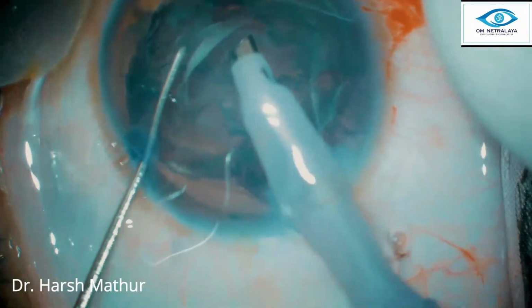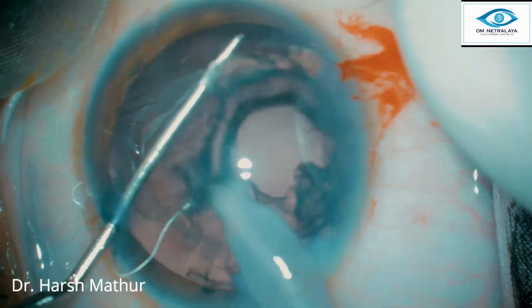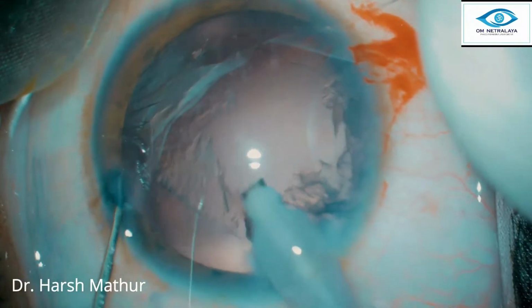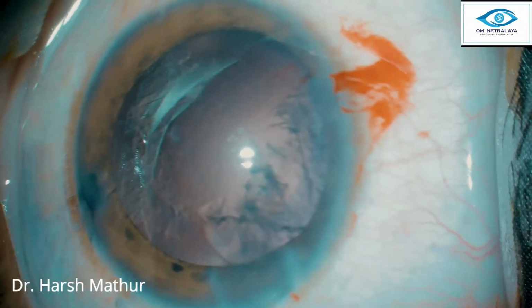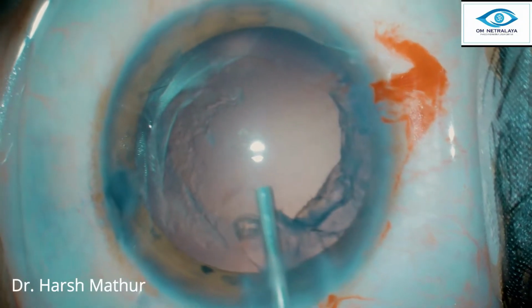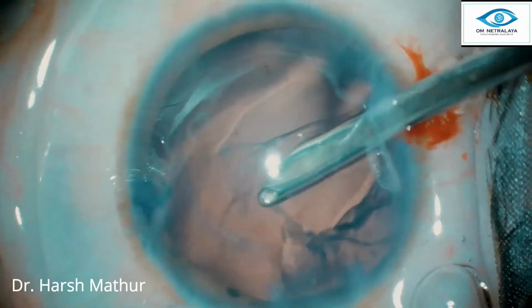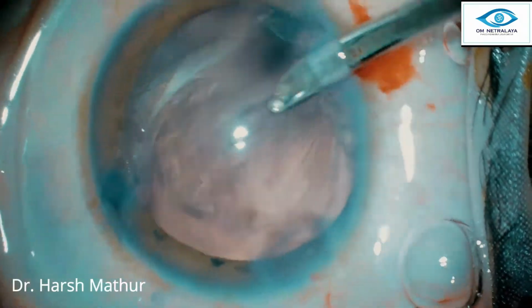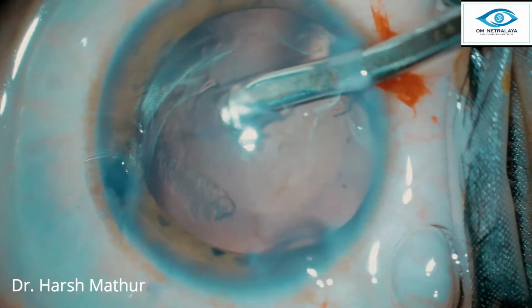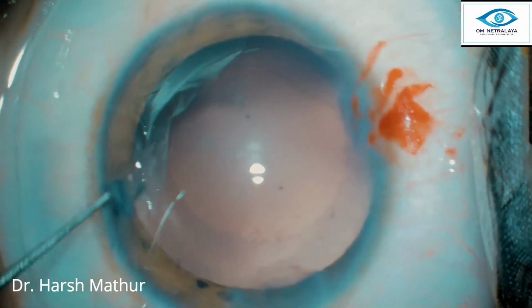And finally the epinuclear sheet is brought up and gently emulsified, and we are able to manage the soft nucleus pretty easily. Now is the time to do the cortical wash. Not much of cortex is left as we had got a good hydrodissection. A bit of primary PCO is there. We leave it as it is and do an ND-YAG later.